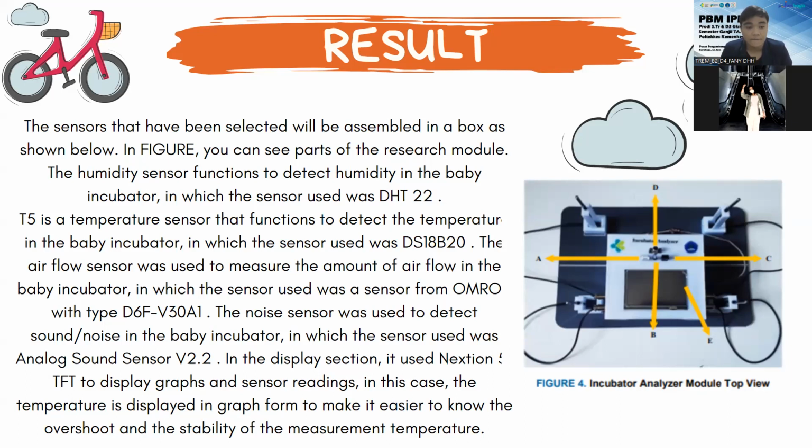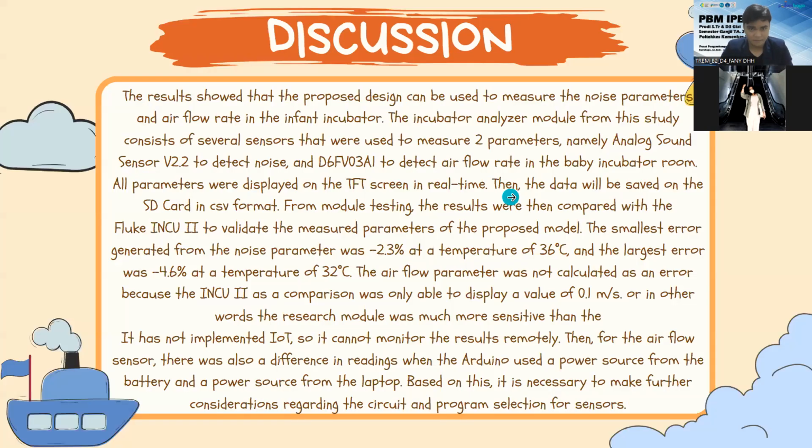In the display section, it used a Nextion TFT to display graphs and sensor readings. In this case, the temperature is displayed in a graph form to make it easier to see the overshoot and the stability of the measured temperature.